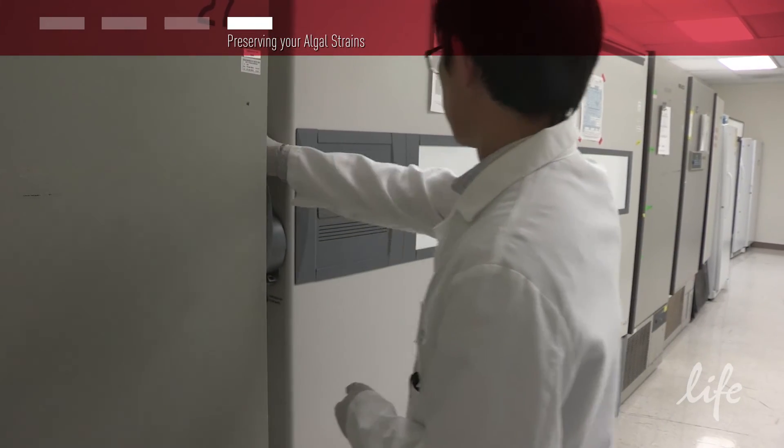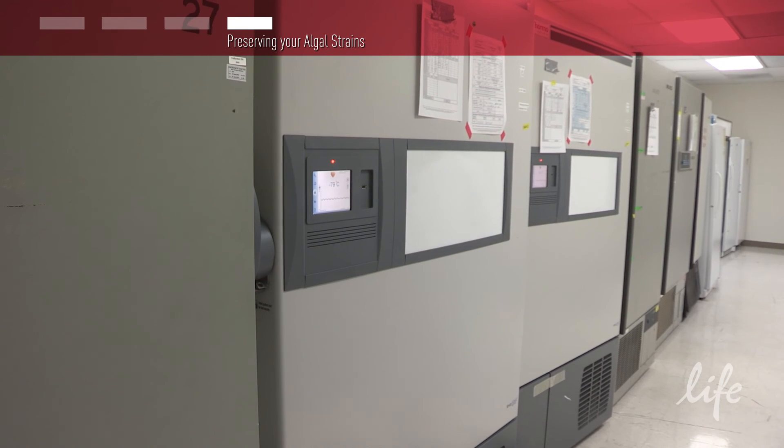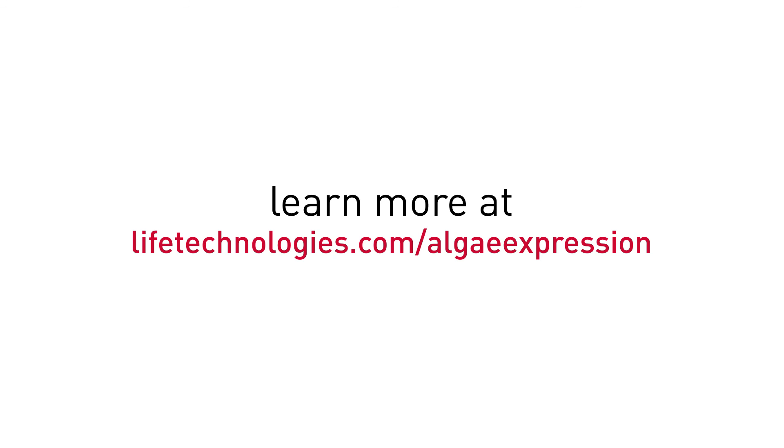Thank you for taking the time to learn how to culture, express, and preserve your algae strains. For more information on the kits used in this video, please visit lifetechnology.com/algae-express.